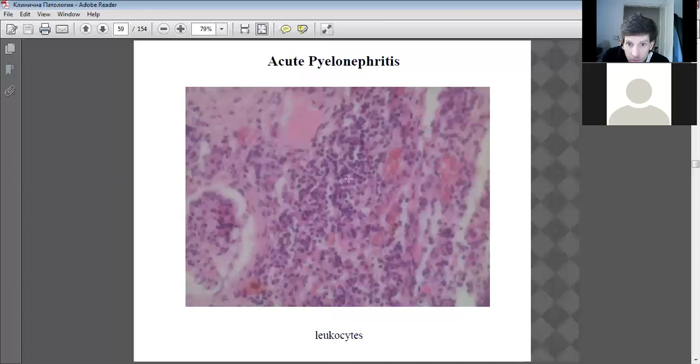Here is a leukocyte, more of a round nucleus. It's less darkly stained than this. This is darker stained, less dark. This is the leukocyte there. So the point in the middle there is a macrophage, and there's another one there, leukocytes there.